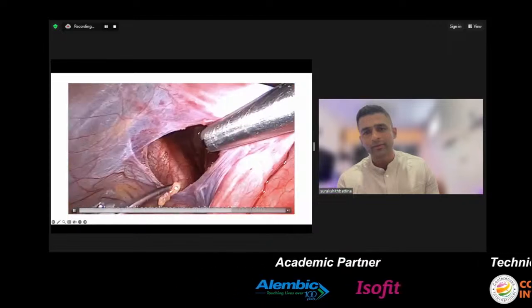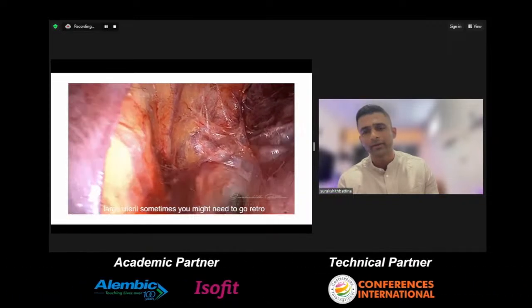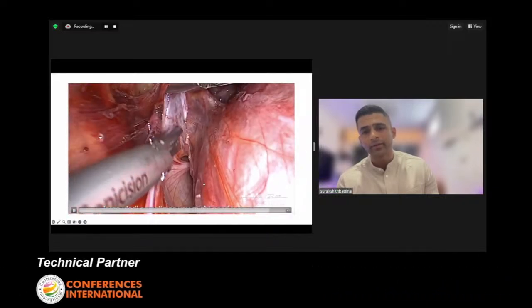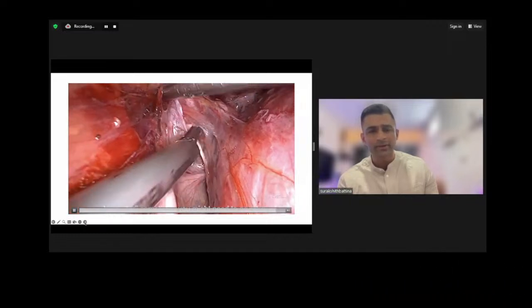Again, sometimes, for this patient, we also had to go retroperitoneal and open up, sorry, to check where the ureter is going, because sometimes the ureter is also very close by. Once you do that, you can go ahead and place a stitch.